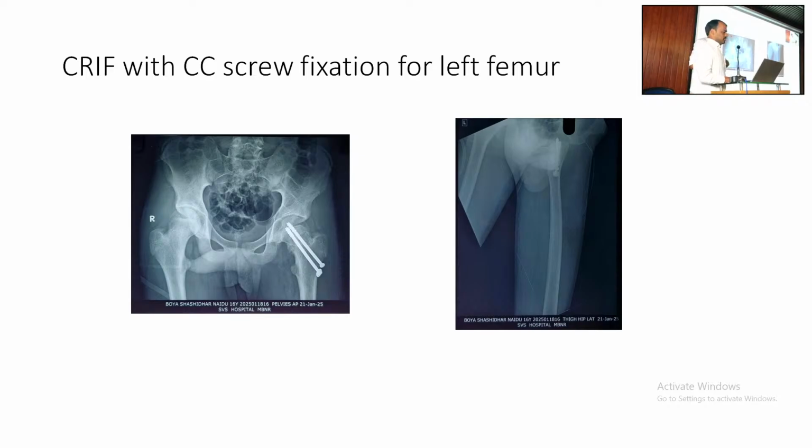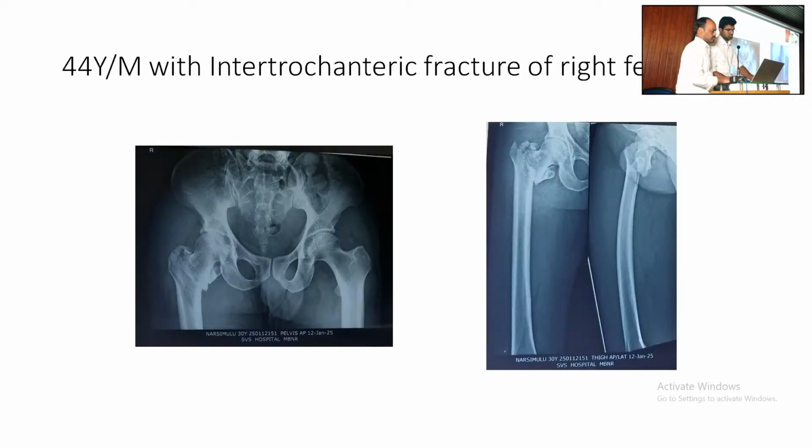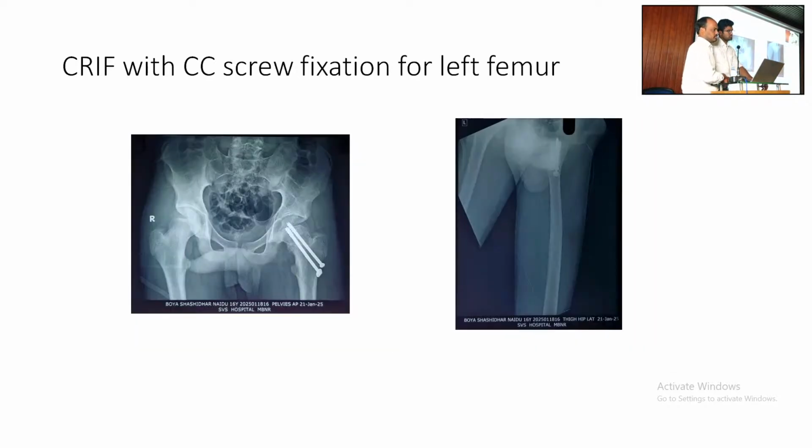Okay, next. Go back. In these cases, the ideal is PCCP, percutaneous compression plating. A screw construct is different from screw and plate. A cantilever plate is better. And it is already more than half united. Whatever you put, or don't put, it will not cause any problem.